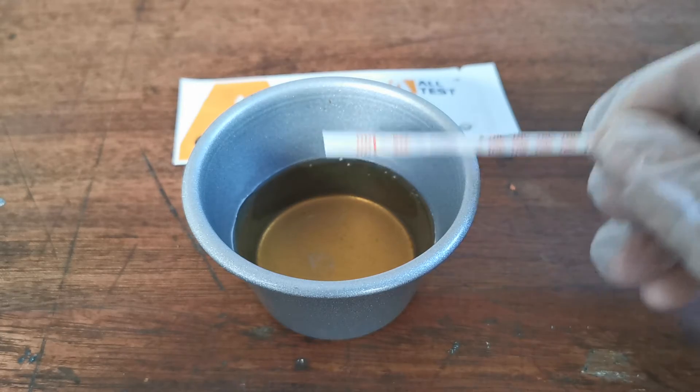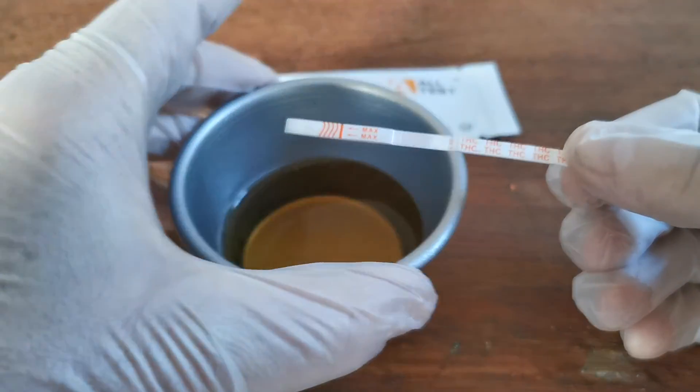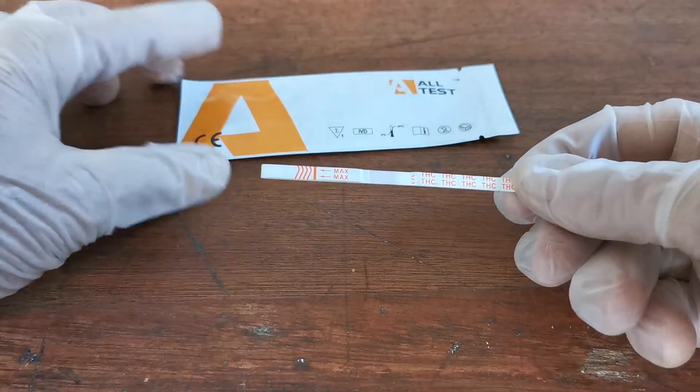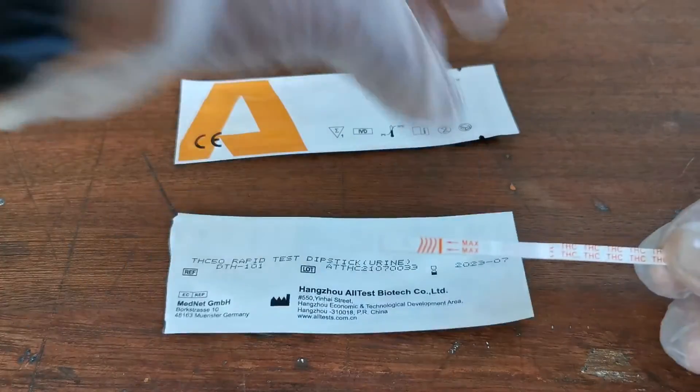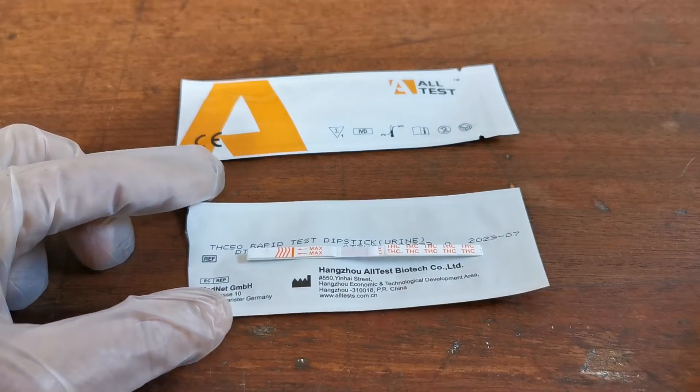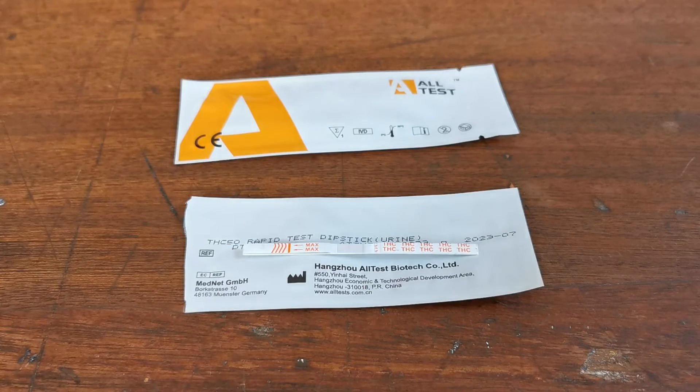After about 10 seconds, just remove the test strip from the urine sample, which can now be removed, and lay the test flat — ideally on the foil — and allow it to run for the specified read time as given in the test strip instructions.